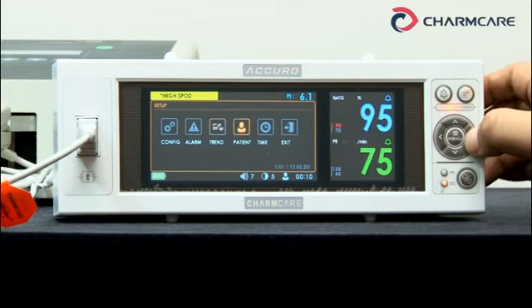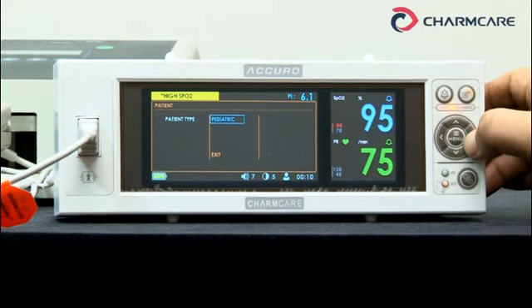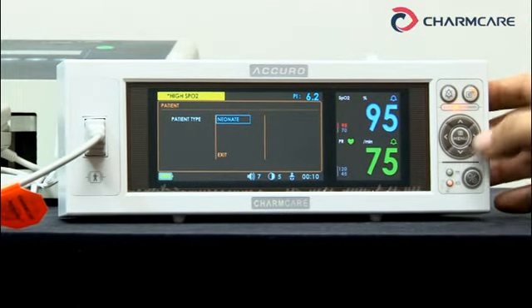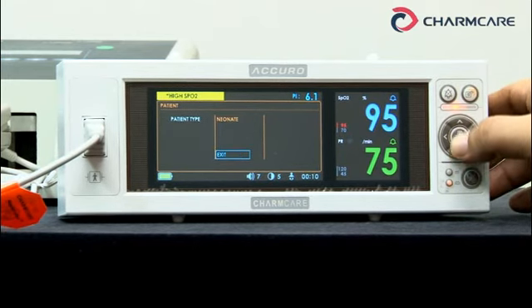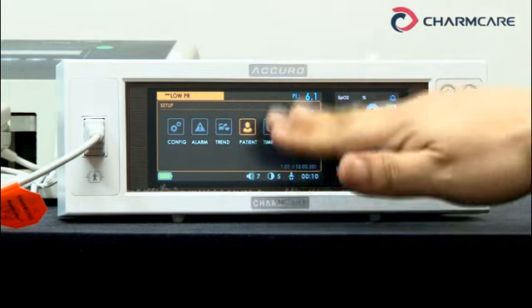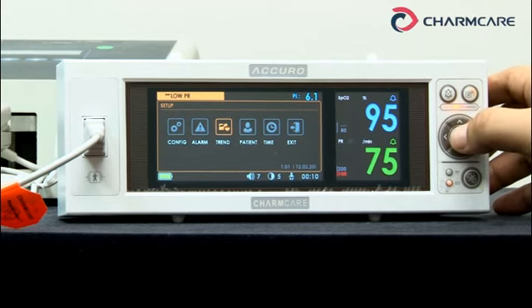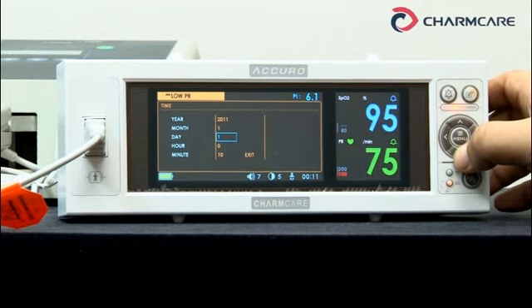Let's go to the patient settings. You can select the patient type here — now it's adult. You can change it to pediatric or neonate. The current sensor is an adult patient sensor. In the case of a neonate, you can select the neonate type. Then exit. Let's go to time — it's the current time. You can set up or change the year, month, day, hour, and minute.